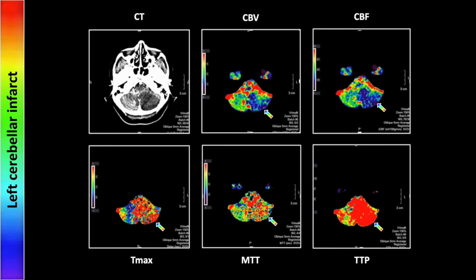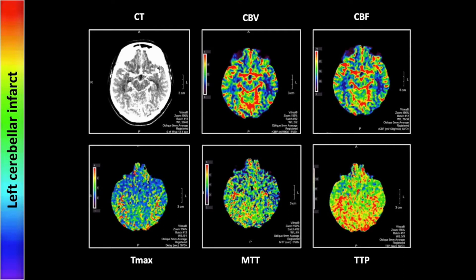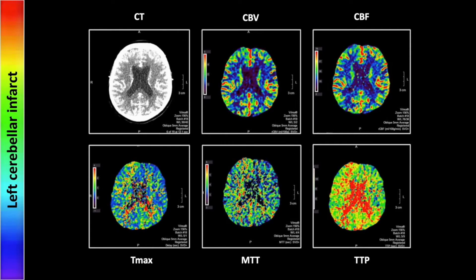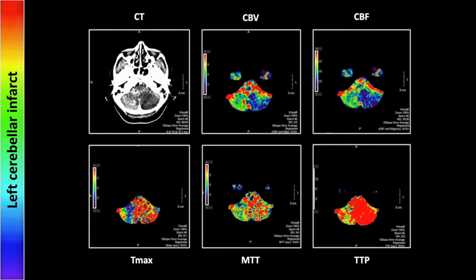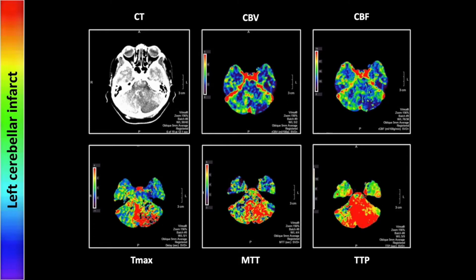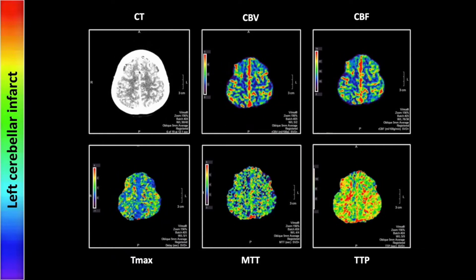Alright, let's move on to a cerebellar infarct. Here we see matching abnormalities of the left cerebellar hemisphere on the CBV and CBF, but also on the Tmax and TTP. The TTP may suggest a little added region suggesting a smallish penumbra, but I think taken in total this is probably infarcted with relatively little salvageable tissue. That is a left cerebellar hemisphere infarct.